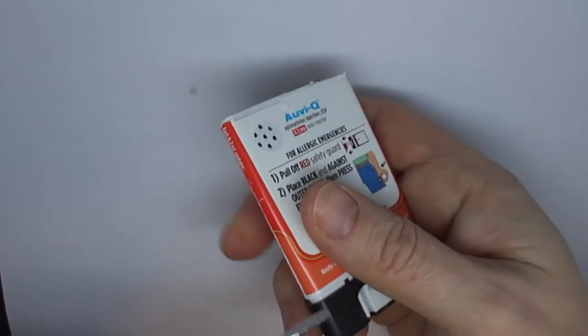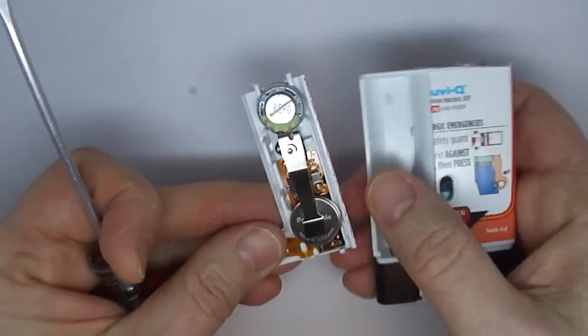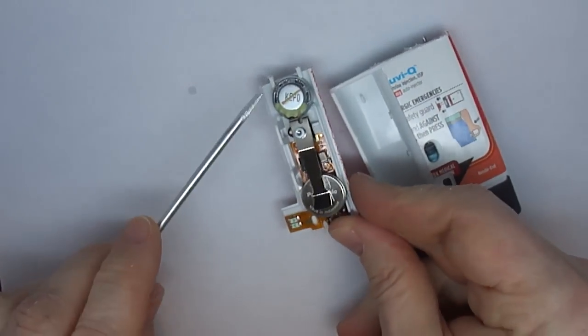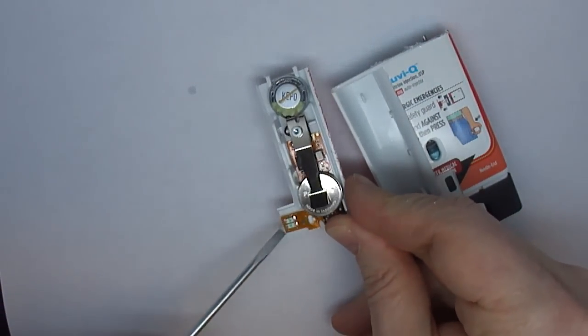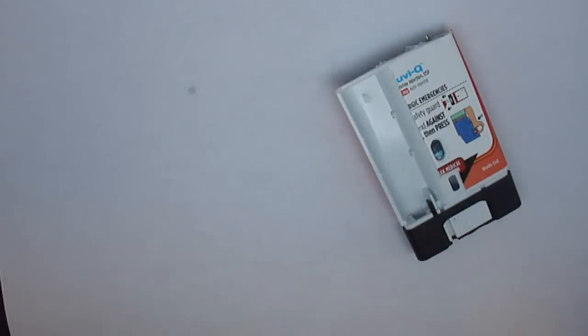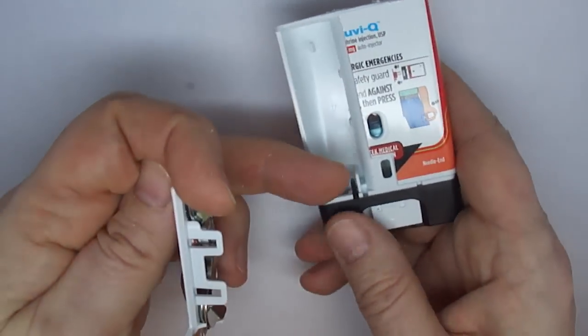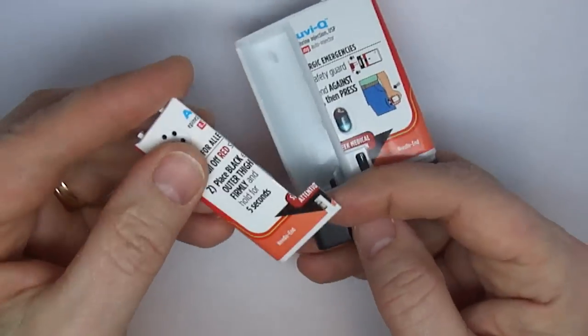The first thing we're going to do is remove that section. This contains a speaker, a circuit board, and the batteries. The only connection between this area and the next area is this little window.